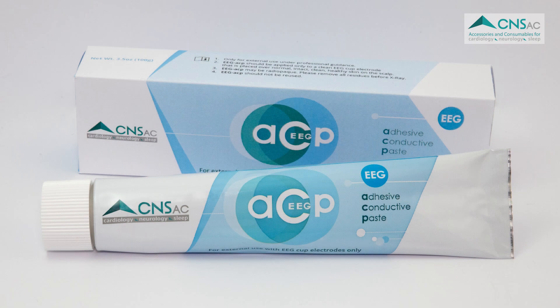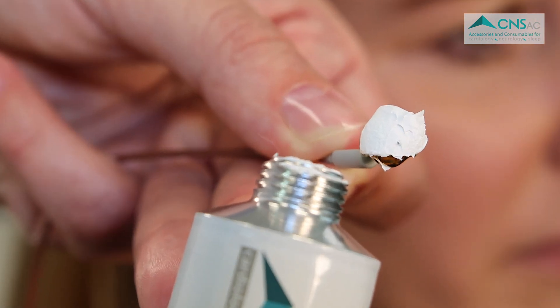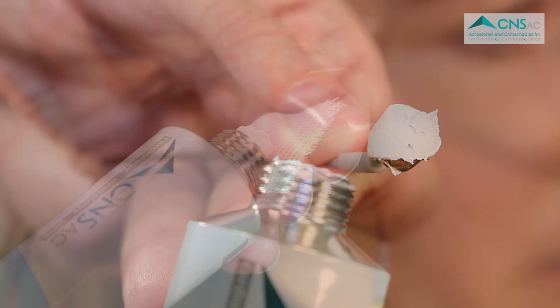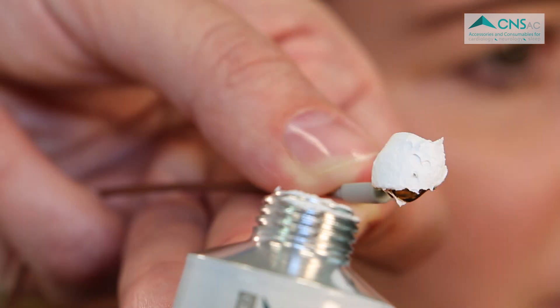This is a short application video for our EEG ACP paste. EEG ACP is a biocompatible, water-soluble, adhesive, and conductive EEG paste developed to enable a quick and secure application of EEG electrodes for sleep studies and long-term EEG monitoring.